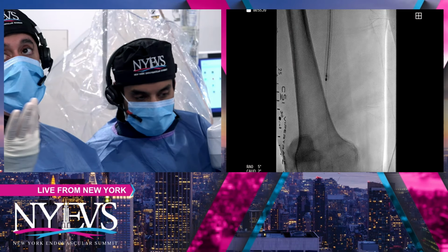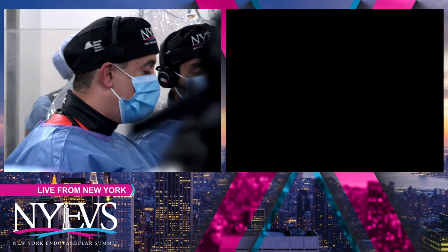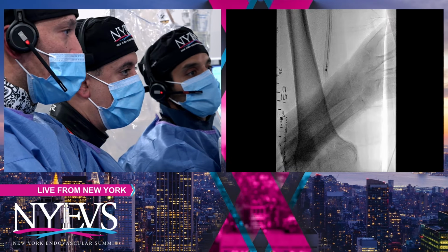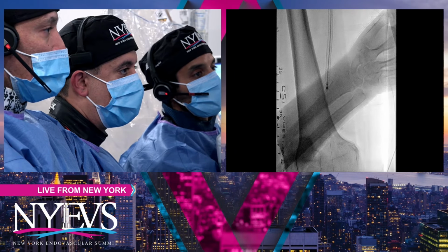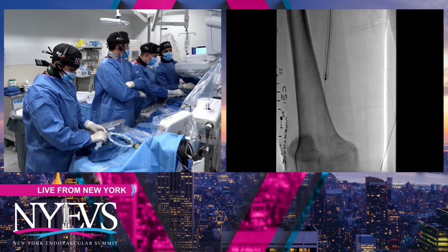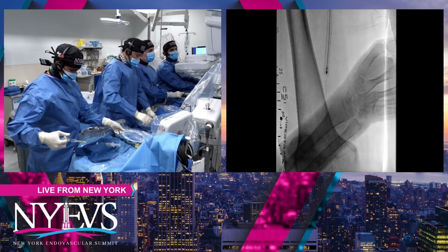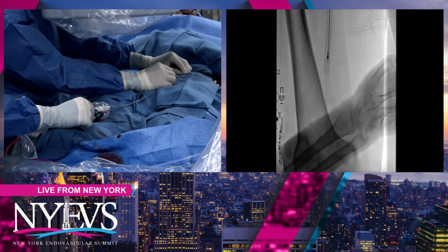For the middle segment, here is the real question I have for the audience. How do you treat that so-called missed segment or the almost zero overlap? What's the thought process on that? I would put a little shorty stent right there, right at that missed overlap section. Yeah, otherwise it's going to be a noticeable failure again. I'm not totally sure that on the day of deployment it was a missed overlap. We all know that if the supera is a little bit elongated, it will find itself, so it may have pulled away from the zilver versus a miss.